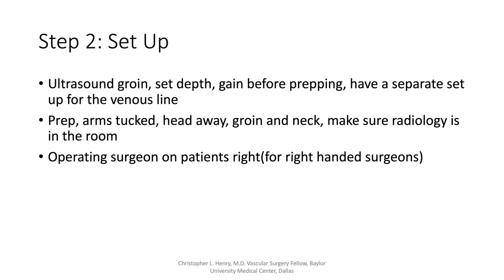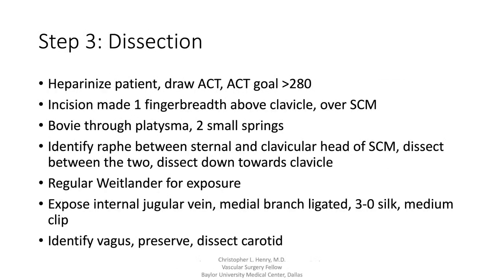The operating surgeon stands on the patient's right, at least for right-handed surgeons. While I'm doing the line, we'll typically start the skin incision up top. We'll heparinize the patient when we start the operation. Make the incision one finger-breadth above the clavicle, go over the SCM, bovie down through platysma, use two springs to provide exposure, and identify the cleft between the sternal and clavicular heads of the SCM.